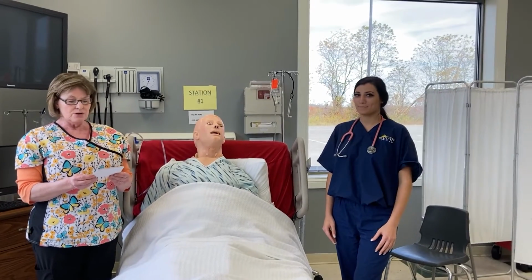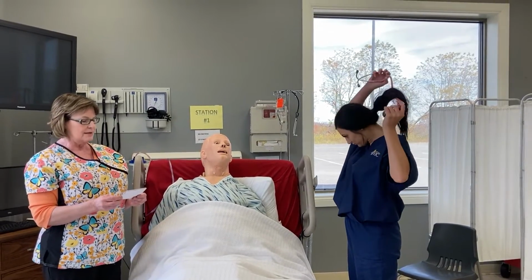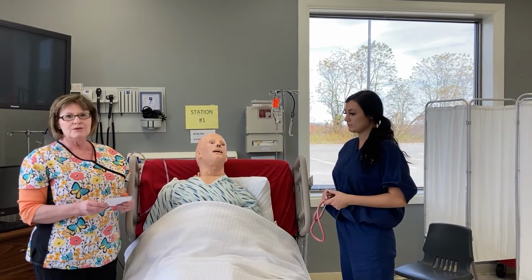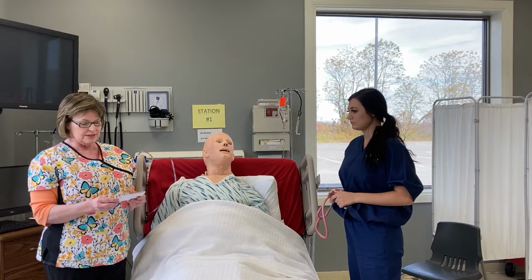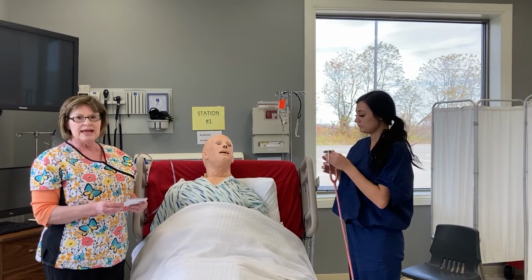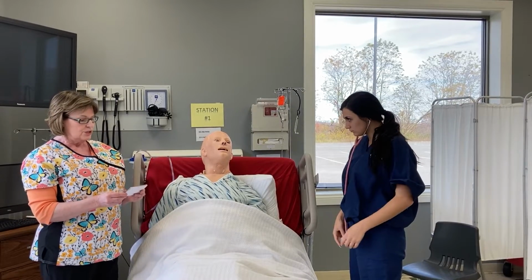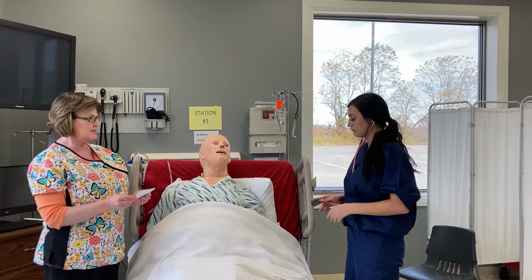Alison has already knocked on the door for permission to enter, washed her hands, and identified the patient using 2 IDs. Relying on her knowledge of anatomy and physiology, Alison will demonstrate the appropriate sequence of auscultating the lungs anteriorly. She will then listen to 1 whole respiratory cycle.